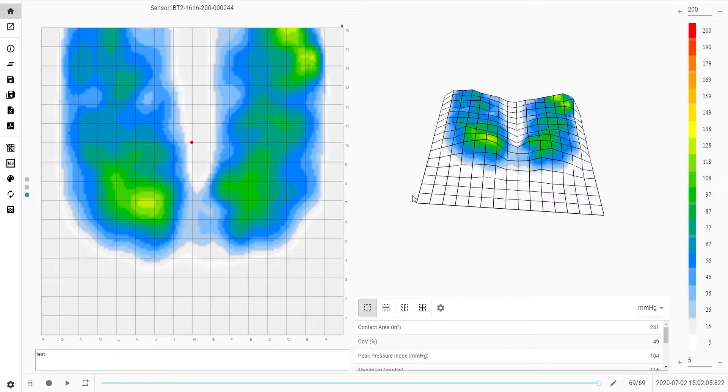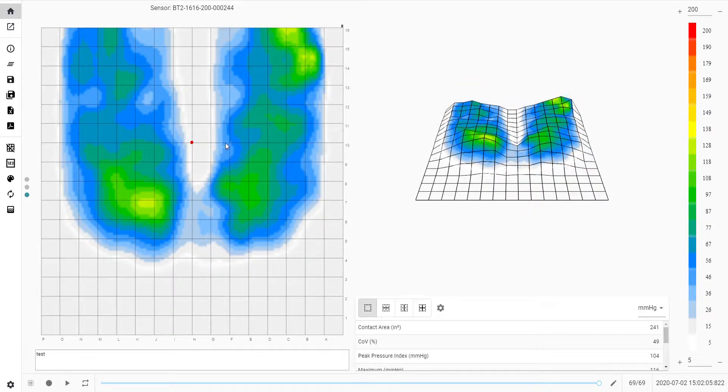The BodyTrack Pro pressure mapping system is competitively priced. Various mat options include seat, torso, and bed, with standard and high resolution options available.